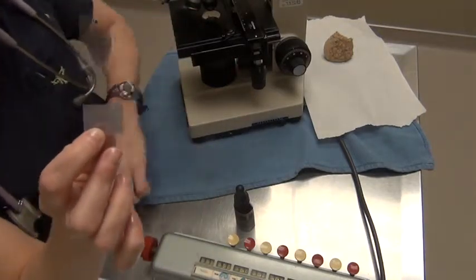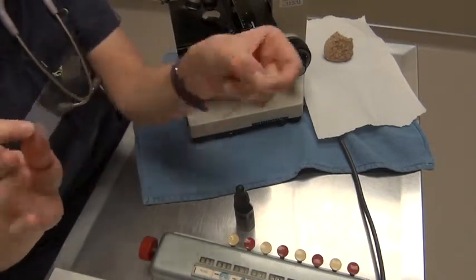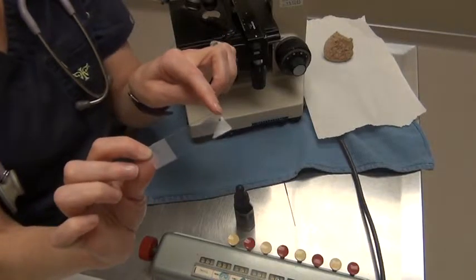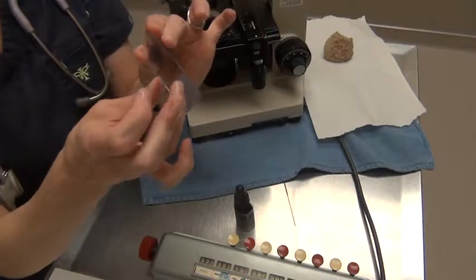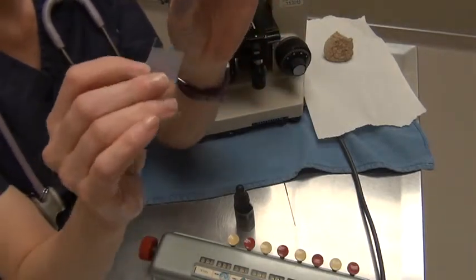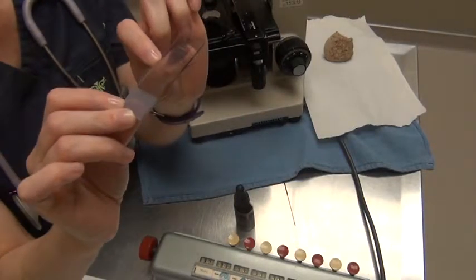I did go ahead and collect a blood sample, and it is in a tube with EDTA, so it's not going to clot. What I've done is I placed a single drop on the slide, used another slide to smear it out, and I did obtain a good technique, and I do have a good slide to look at. I do have a nice feathered edge on the end, and that's what you want on a good blood smear.